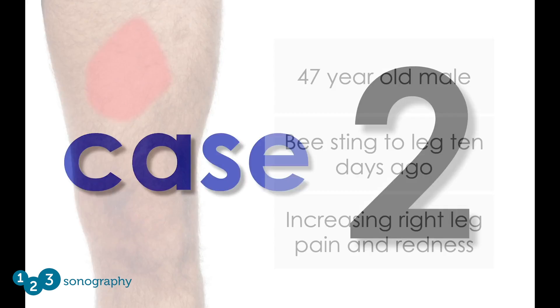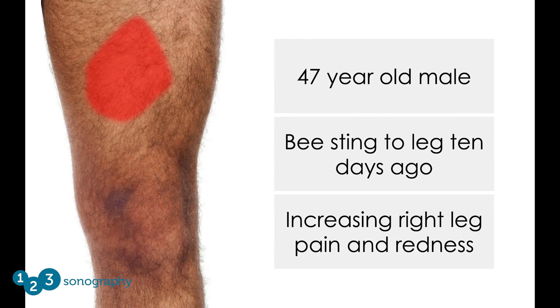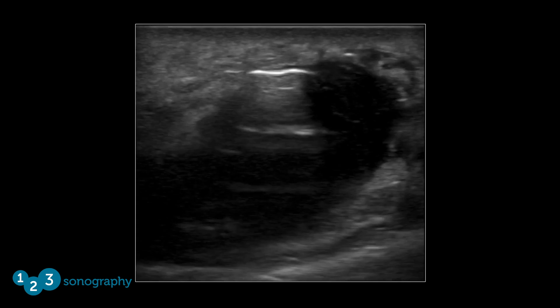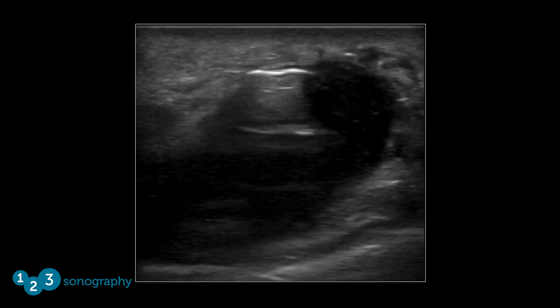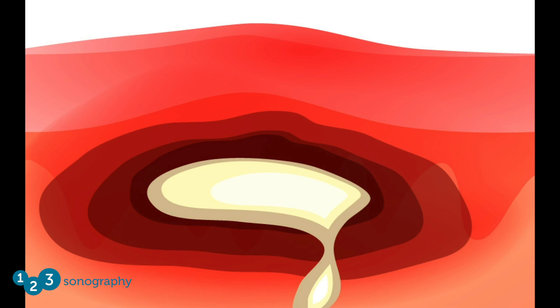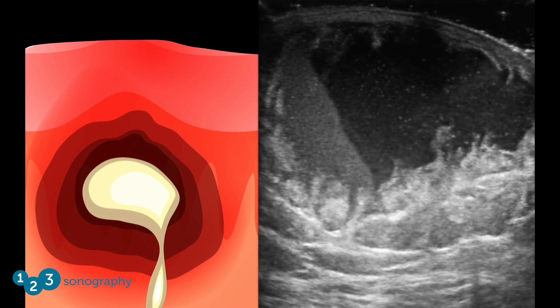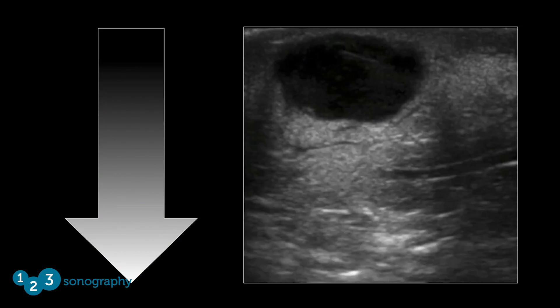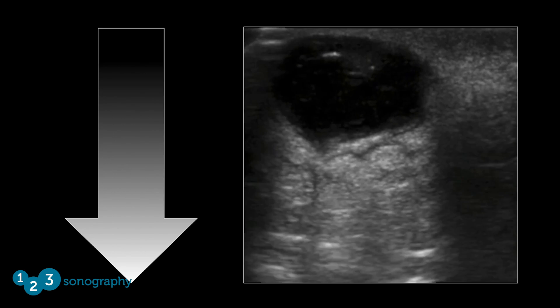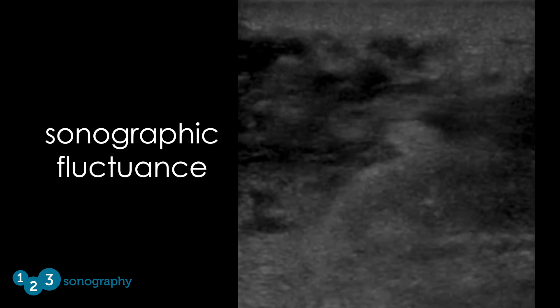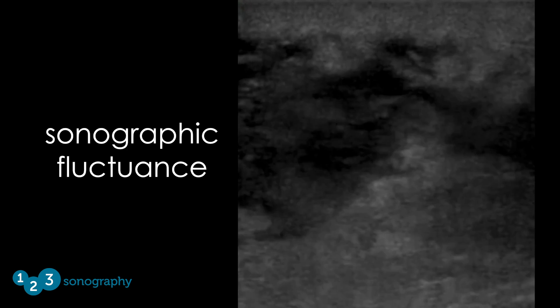Case number two: a 47-year-old male stung in the thigh by a bee ten days ago, with increasing pain and tenderness around the sting site. As you scan the area, you see evidence of cobblestoning. However, you also find a relatively large area with mixed echogenicity — this is the classic ultrasound image of an abscess. An abscess demonstrates a heterogeneous image made up of both solid and liquid components. Because of the fluid in the abscess, most will create posterior acoustic enhancement. With compression, the fluid will move between areas of the cavity, a finding referred to as sonographic fluctuance.